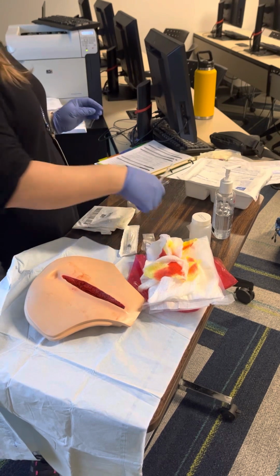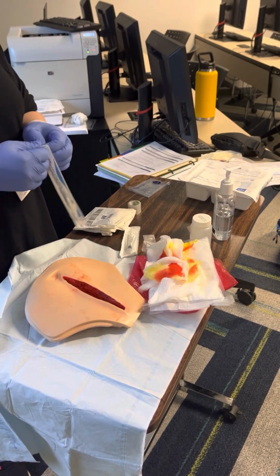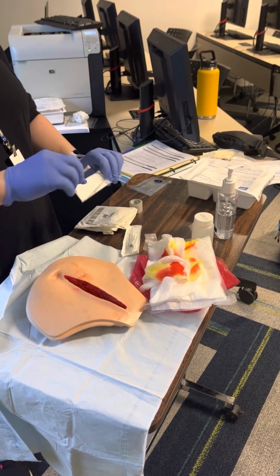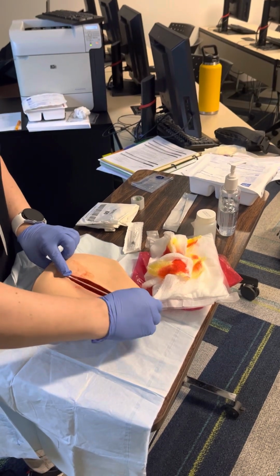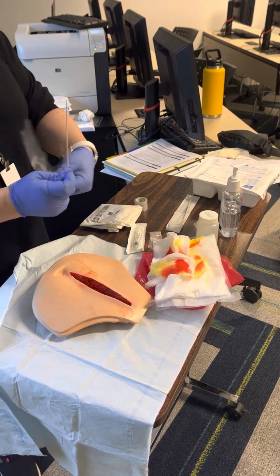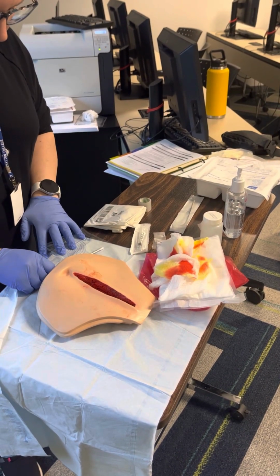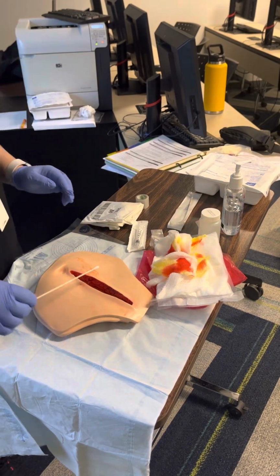I'm gonna take my cotton tip applicator and I'm going to measure the wound. I'm gonna open it up. I take out my cotton tip applicator. I'm gonna first do the length, so I'm gonna start at the top of the wound. I'm gonna go to the bottom. I'm gonna take my wound measure. I'm gonna do it in centimeters. And this wound is 13.4 for length.